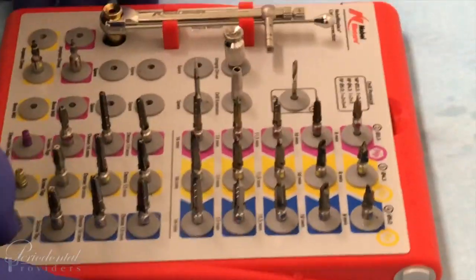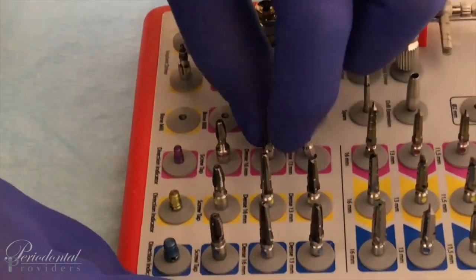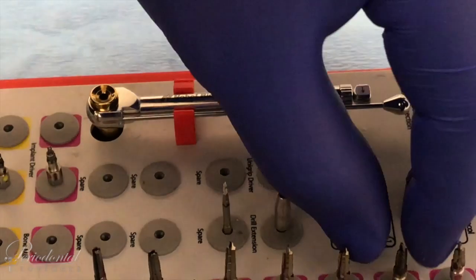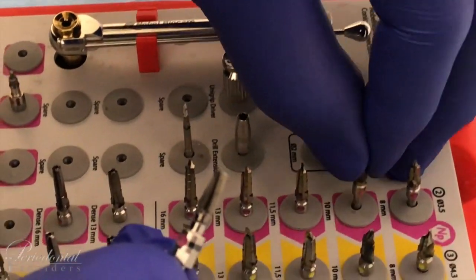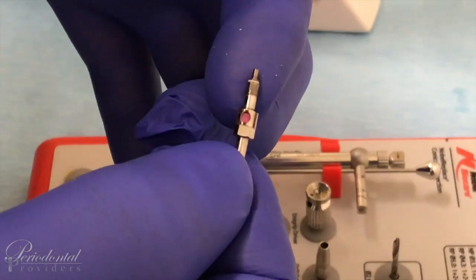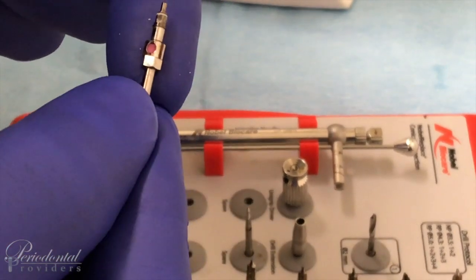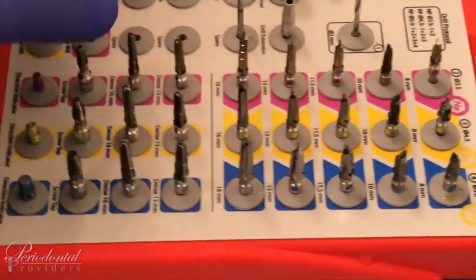Once the doctor has completed drilling in the size and length, they may ask for a tapper for tapping of the site. As you can see, the tapper has different grooves in comparison to the drill bit — this allows the implant to go in with no force. Once tapping is done, your doctor will ask for your driver, which looks like a little plug that will be inserted into the implant itself. Always make sure that every bit being utilized goes back into its proper placement.